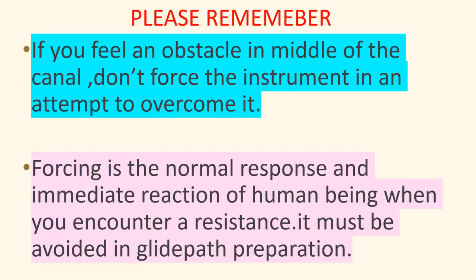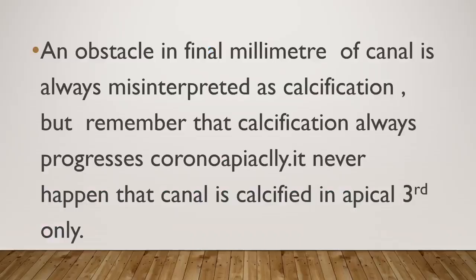Please remember, if you feel an obstacle in the middle of the canal, don't force the instrument in an attempt to overcome it. Forcing is the natural and immediate reaction of a human being when you encounter a resistance. It must be avoided in a glide path preparation. An obstacle in the final millimeter of the canal is always misinterpreted as a calcification. But remember that calcification always progresses coronoapically. It never happens that the canal is calcified in the apical third only.